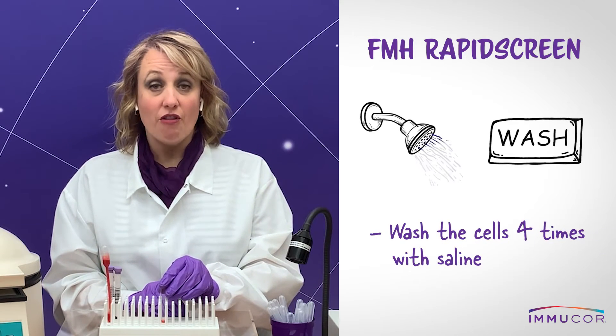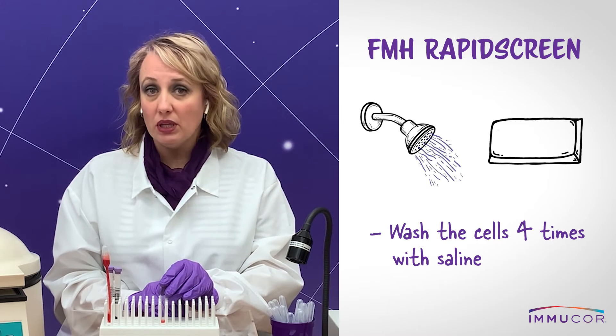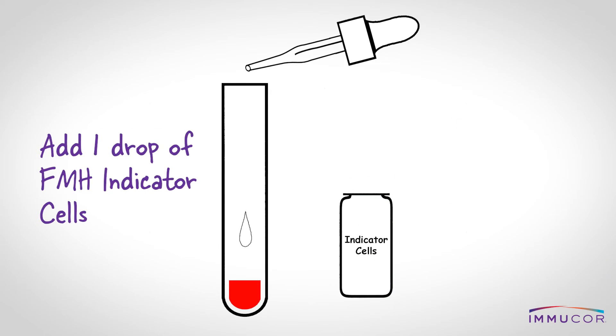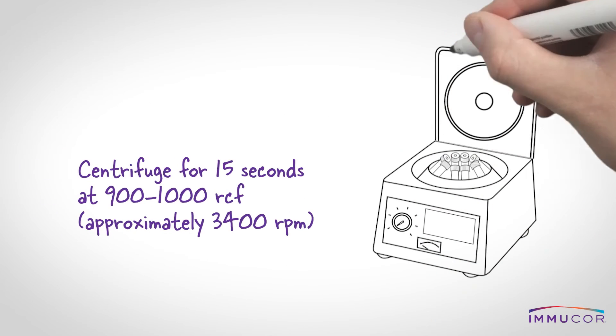After incubation, wash the cells four times with saline, being careful to decant the saline completely in between washes. After washing, add one drop of FMH indicator cells to the tube. Mix gently and centrifuge.